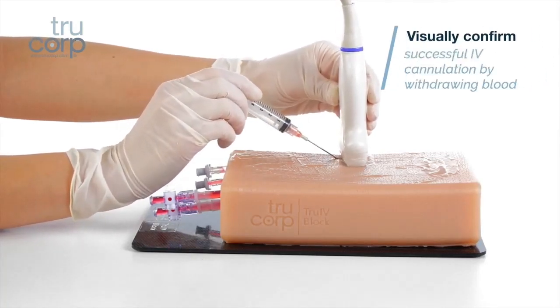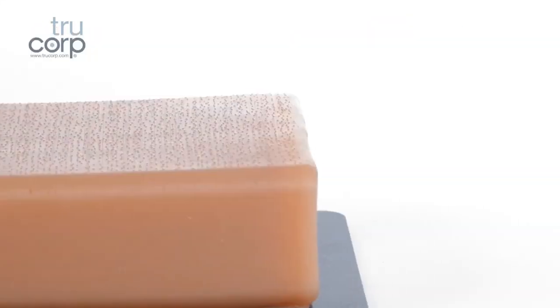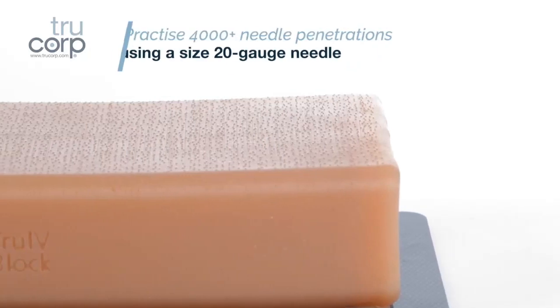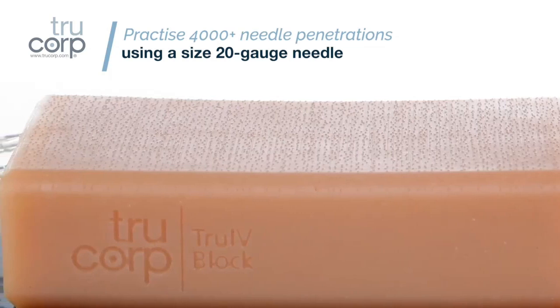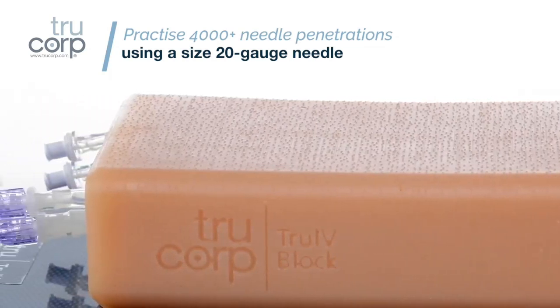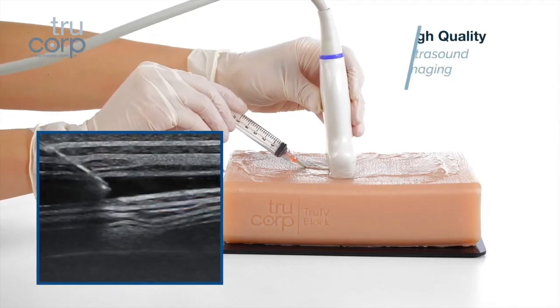Learners can visually confirm successful IV cannulation by withdrawing blood. Unique self-regenerating True Ultra materials allow users to practice 4000 plus needle penetrations using a size 20 gauge needle.